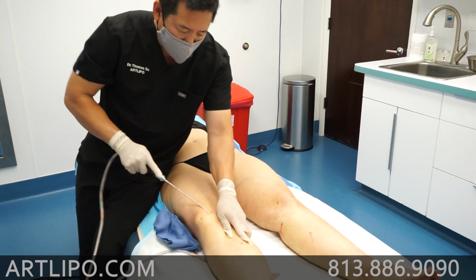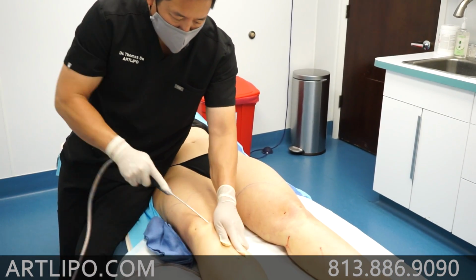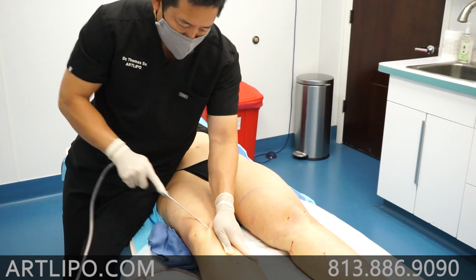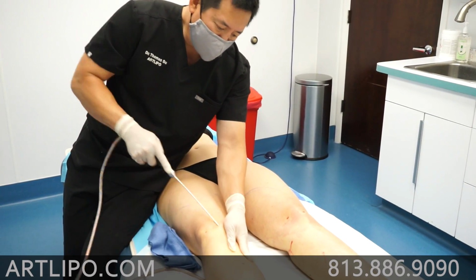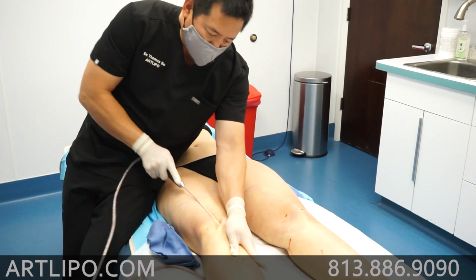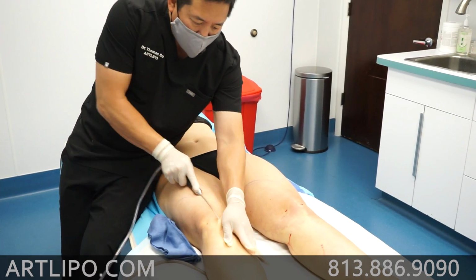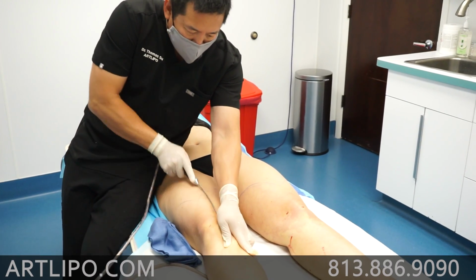Our patients like, hey Mary, how you doing? Doing great. Okay, cool. And so patients are wide awake. Hold it tight a little bit. Tighten it up. Okay, good. Hold it tight right there. So when I do lipo, it's a little bit like a boot camp. I'm your coach, and I ask you to hold the muscles tight so I can feel as I'm sculpting around the shape of the muscle underneath, so that we get the accurate high definition look.